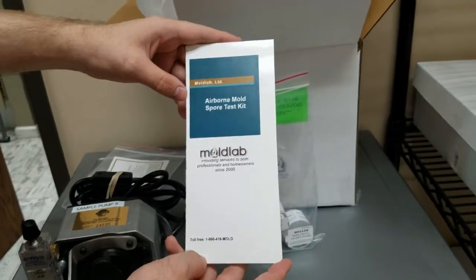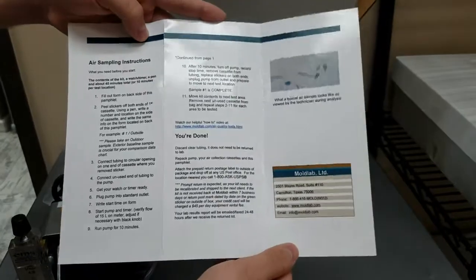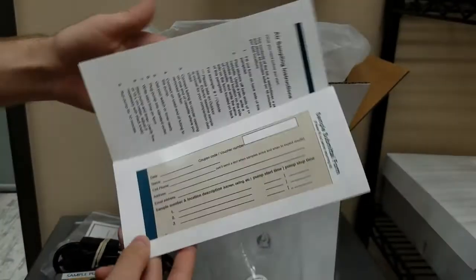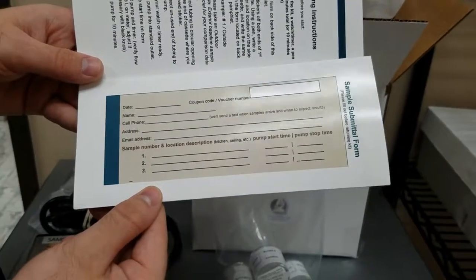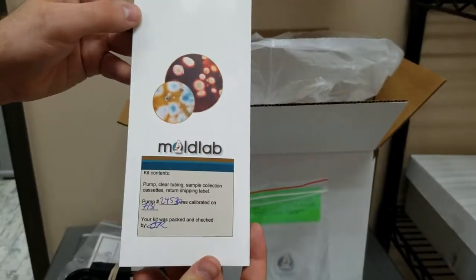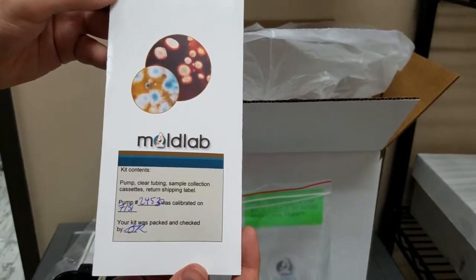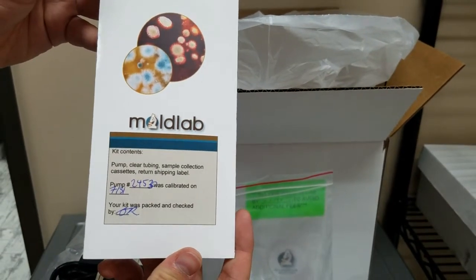This is what our pamphlet looks like — it has the instructions on how to take the mold samples. If you flip the pamphlet over, you'll see the sample submittal form. Please have all the information filled out and have it sent back along with your samples. The back of the pamphlet also has information on the pump number and its calibration date.